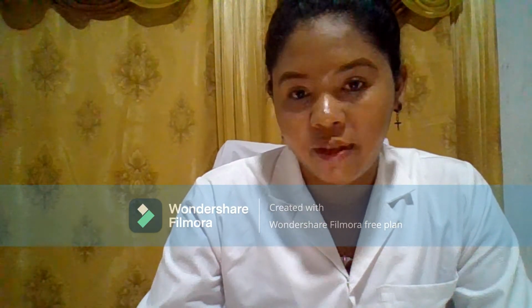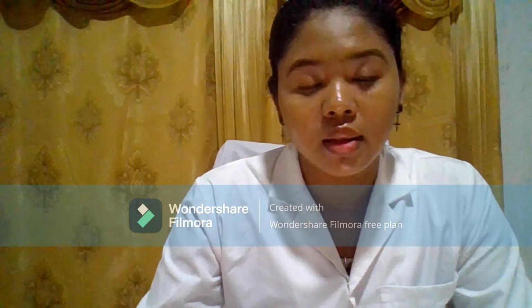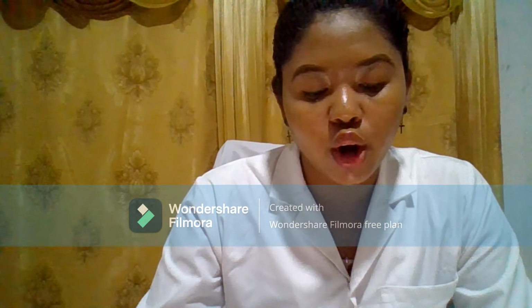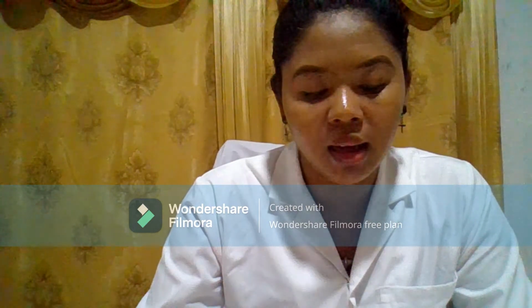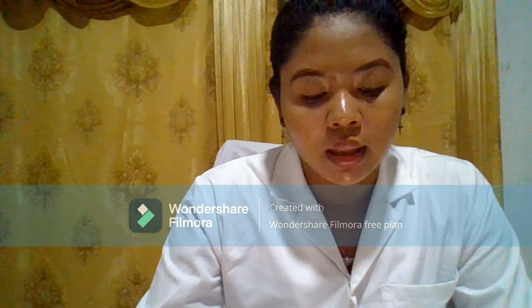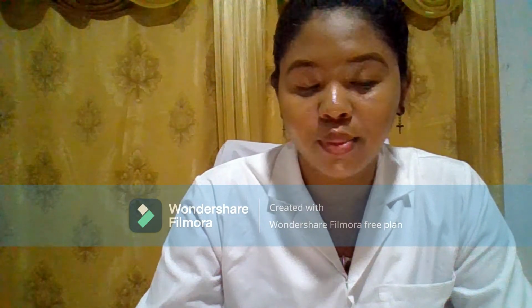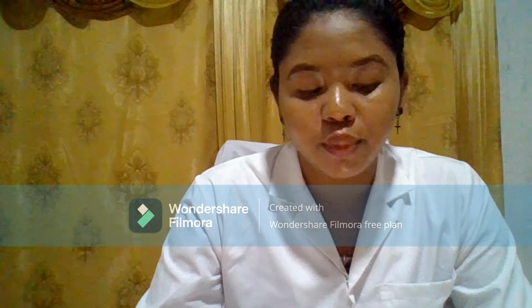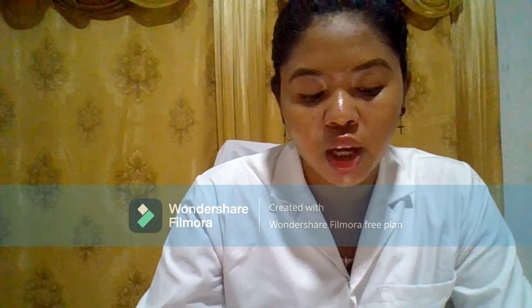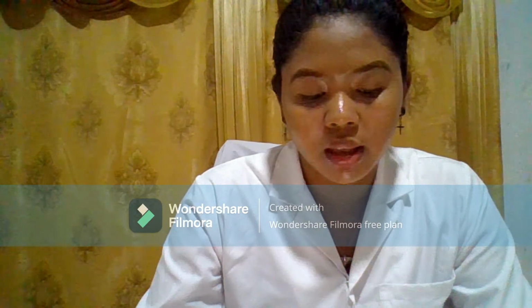Steps to follow if a patient starts to faint during venipunctures. Step 1 is to release the tourniquet and remove and discard the needle as quickly as possible. Step 2 is to apply pressure to the site while having the patient lower the head and breathe deeply. Step 3, talk to the patient. Step 4, physically support the patient.